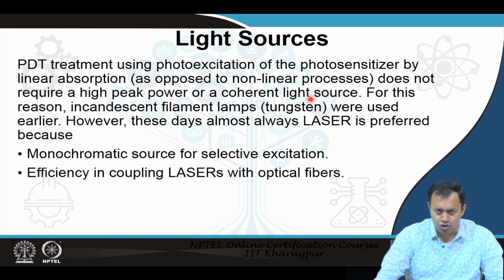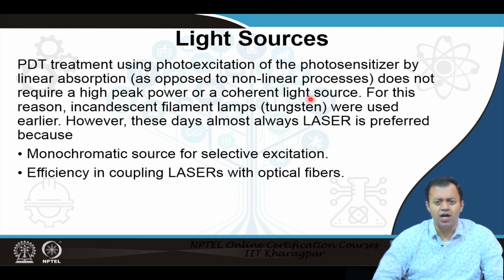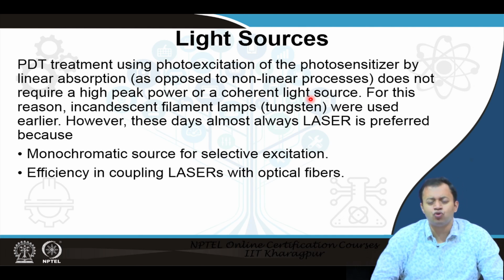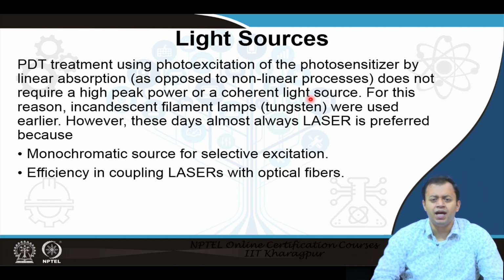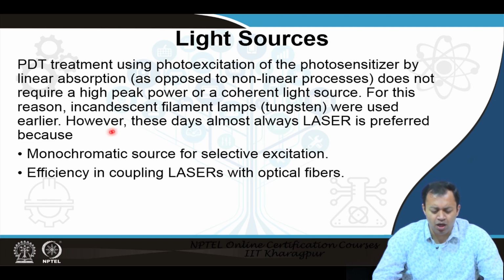The excitation of a photosensitizer usually follows a linear absorption pattern, and it does not require a high peak power or a coherent light source. If the drug is sensitive enough and you shine light onto it, especially in skin treatment, a lamp of the correct wavelength can perform PDT. You do not require a very high peak power or a coherent light source.